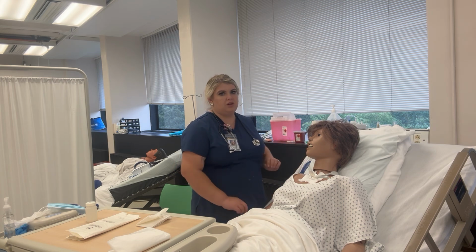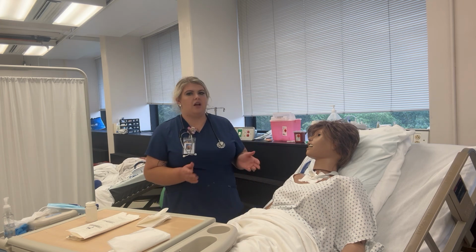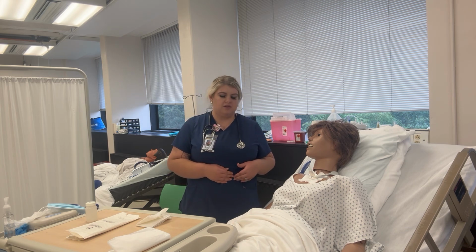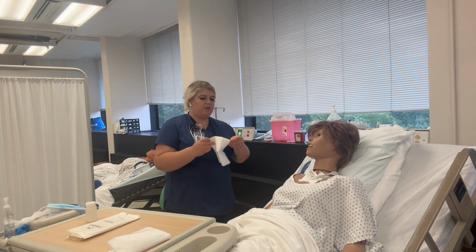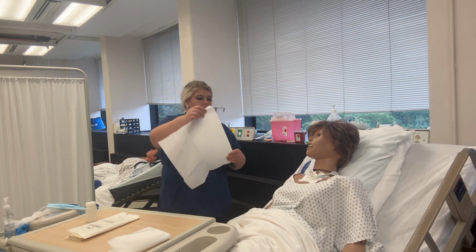We're then going to again make sure that we are checking the O2 while we're doing this procedure and the patient's respirations. We're going to wash hands, and then we're going to apply a drape in case there would be any secretions that were to come out while we're doing suctioning.